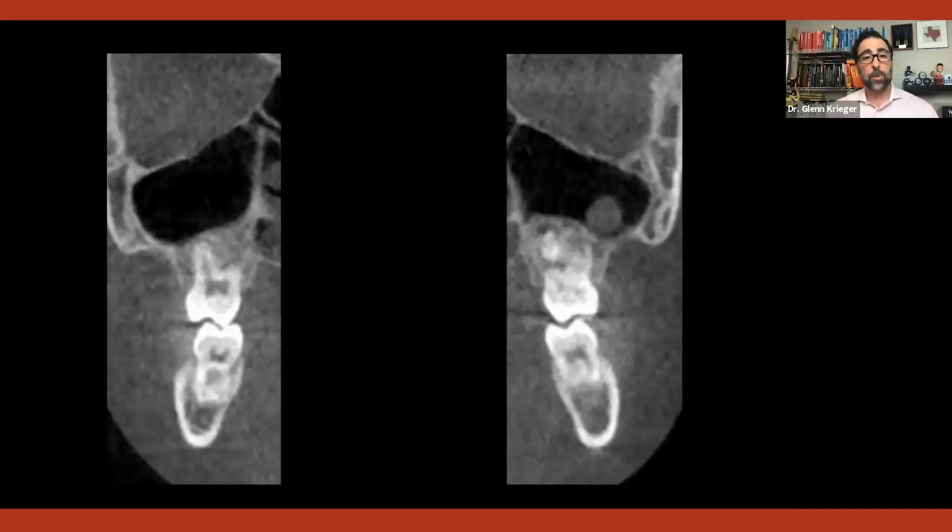But at the end of the day, if I said, well, I'm going to do an expander, a lot of restorative dentists would look at me and say, why are you expanding this child? He doesn't have a crossbite, but he does. He has what you'll refer to almost as a virtual crossbite, a silent crossbite. The alveoli actually are in crossbite, for lack of a better description.